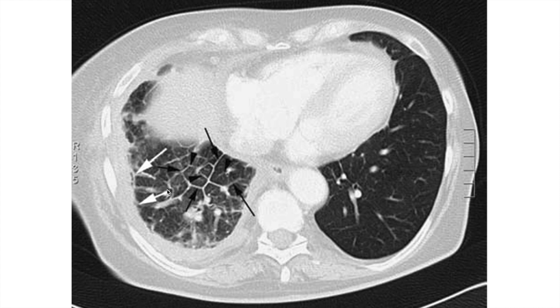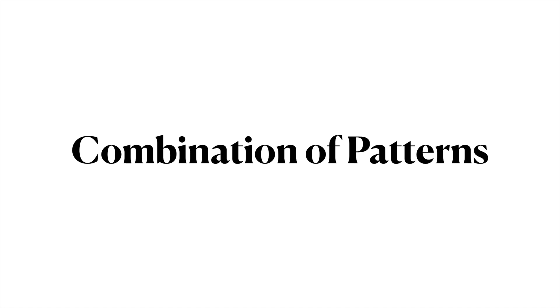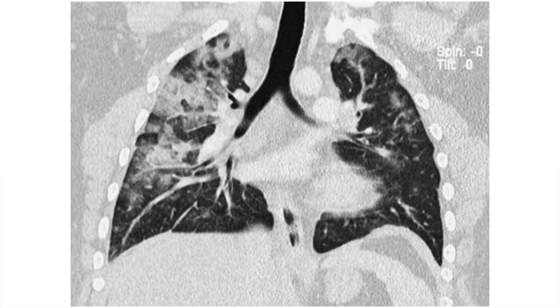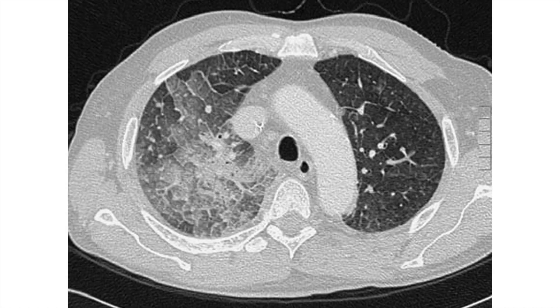Here we can see interstitial thickening presenting as a linear pattern. There can be a combination of these four patterns that may be pathognomonic of a particular disease. For example, areas of consolidation and ground glassing combined with a reticular linear pattern is called crazy paving.